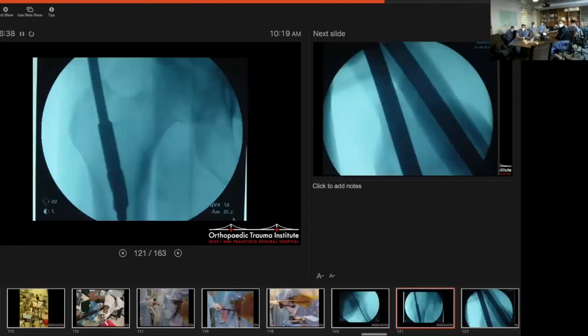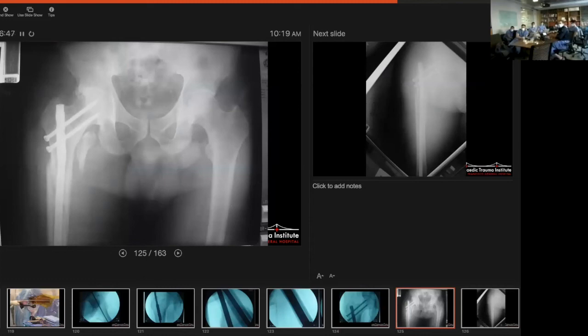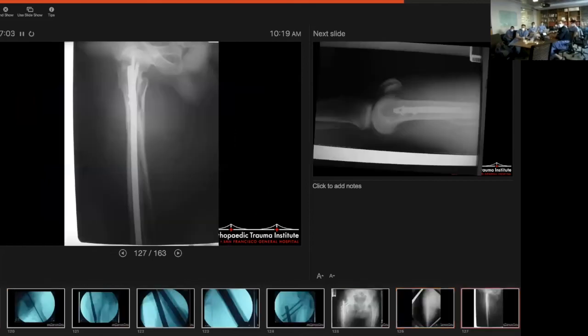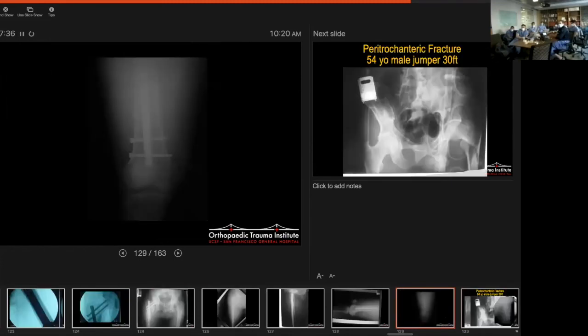The nail goes in and that's the final image. On the lateral, notice that the lesser troch is broken — so it's almost impossible to use it as a sign. Nobody cerclages that in the US; they do in Europe in some places. There's the AP and lateral. Notice there's a very long fragment that goes all the way down to the middle of the shaft. These are the fractures where you really have to be cognizant of flexion of the proximal piece. You want to get a good lateral view intraoperatively and make sure the anterior part of the neck is in line with the shaft.